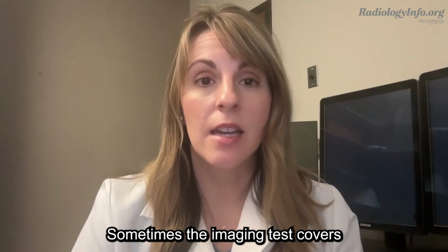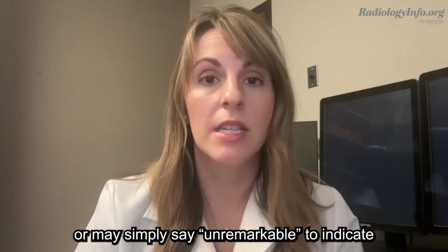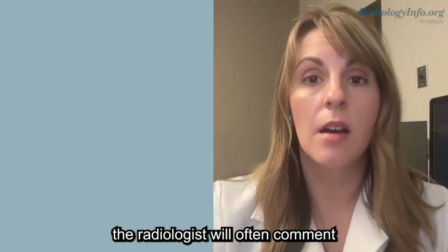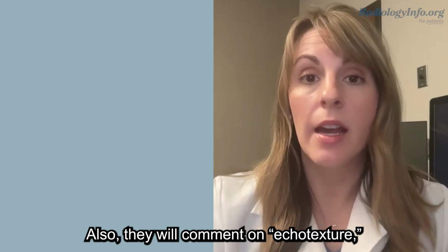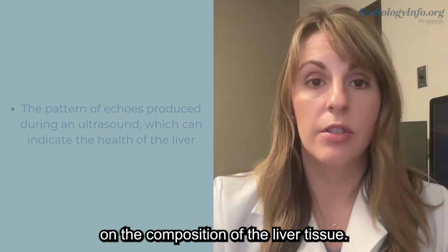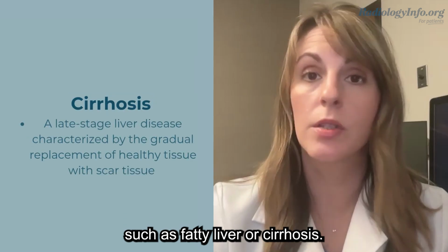Sometimes the imaging test covers an area of the body, but the report does not list any findings, or may simply say unremarkable to indicate that it looks normal. For the liver, the radiologist will often comment on its echogenicity, or how well the tissue reflects the ultrasound wave. Also, they will comment on echotexture, which provides information on the composition of the liver tissue. These can help diagnose a normal liver or indicate possible liver disease, such as fatty liver or cirrhosis.